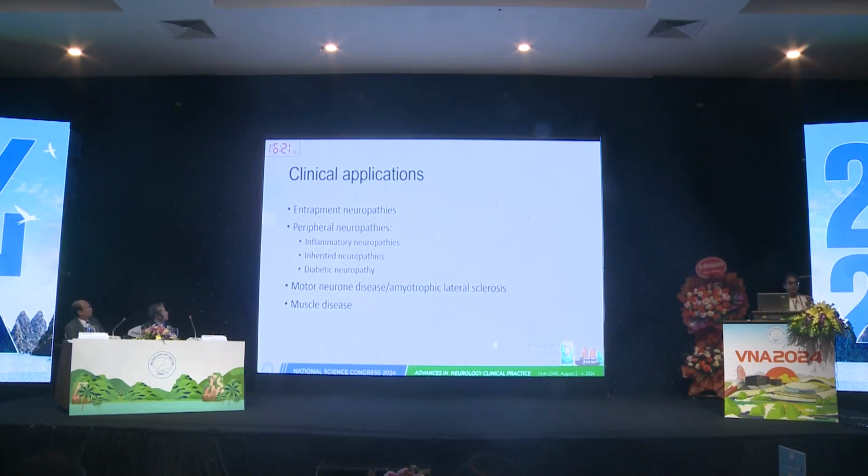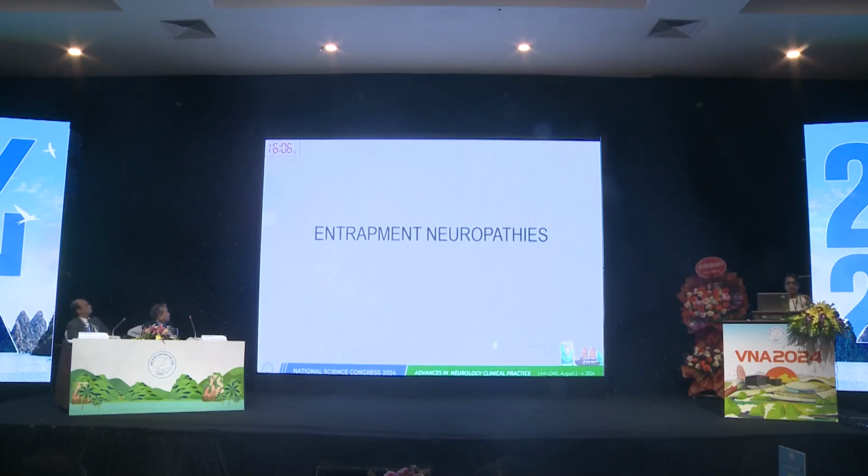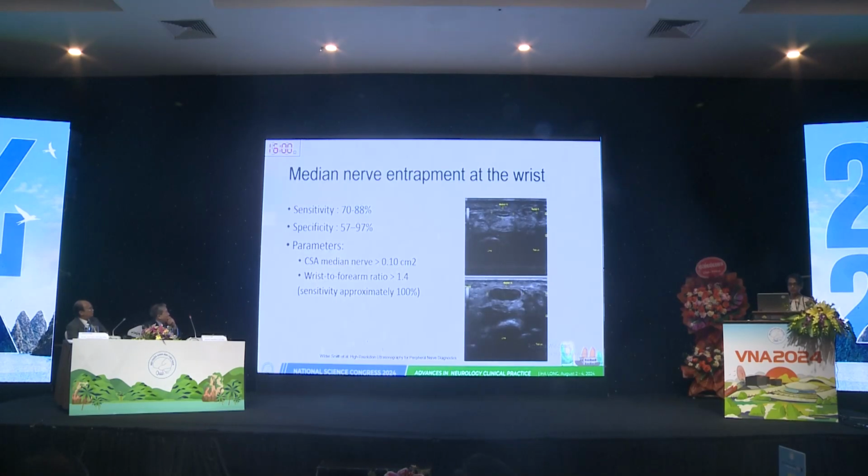The clinical applications would typically be entrapment neuropathies, peripheral neuropathies, motor neuron disease or ALS, and also muscle disease. I'm going to go through it step by step. For entrapment neuropathies, the most common, of course, we know is median nerve entrapment or carpal tunnel syndrome.